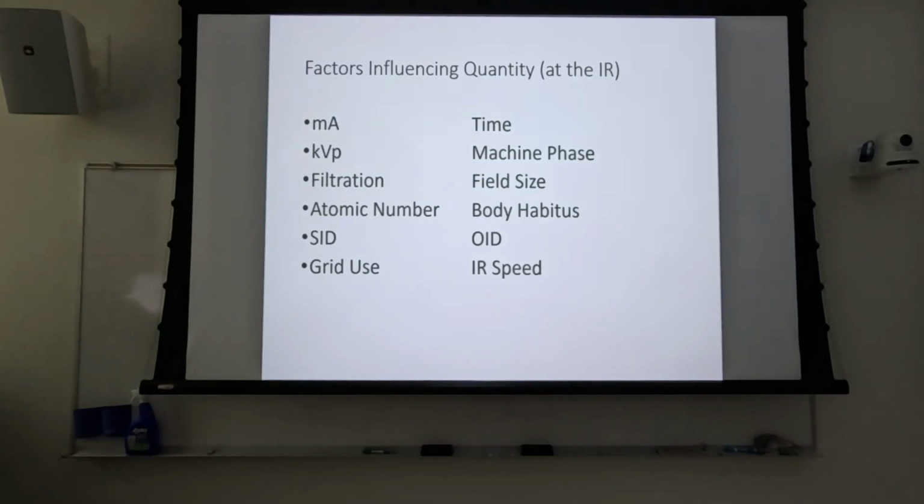We do see a change in contrast because of the soft tissue, right? Because of the increase in size. But if we were to use a higher versus a lower kVp, we just don't see that all that much anymore. So again, the technology is there. It's just the theory and the practice behind using that technology has not caught up yet.